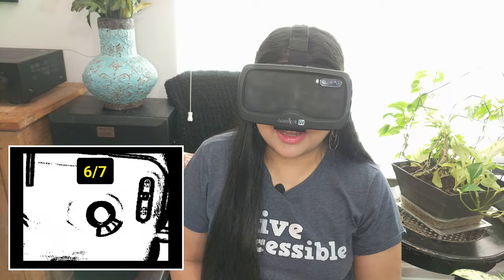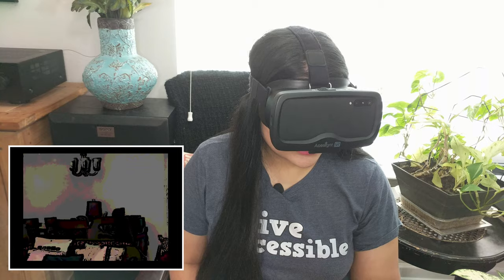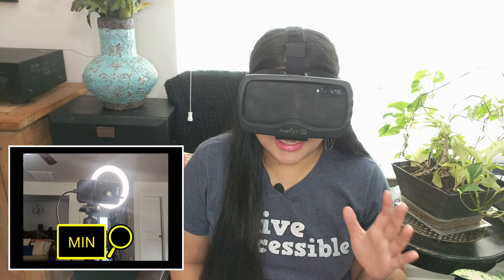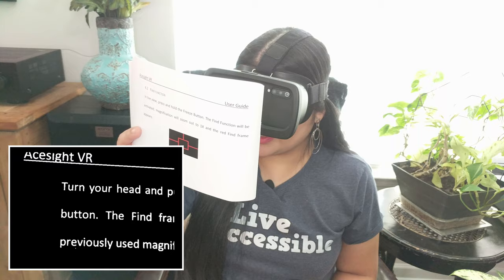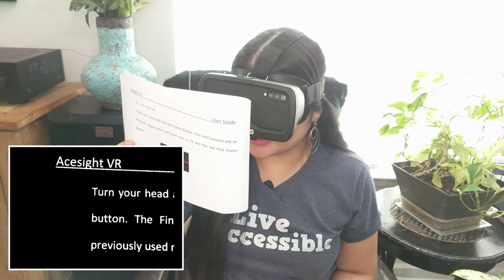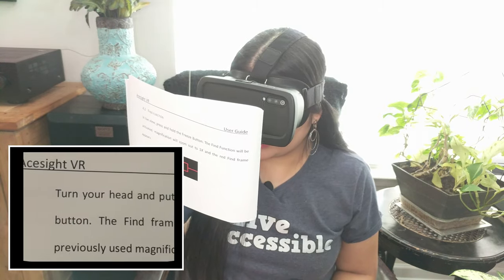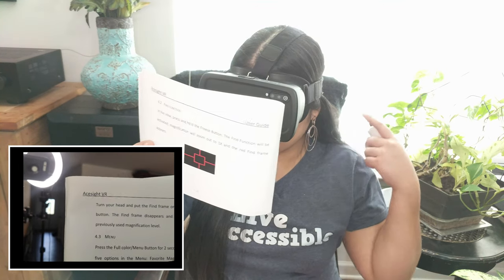And then you have the black on white. And then this one has color, but it still uses an outline. So that just adds contrast to whatever you're looking at. Another thing that you can do is while you are reading and you are in a color filter, if you press that middle button one time, it'll take you to the color mode. And if you press it two times, it'll take you to the color mode and to the minimum zoom.